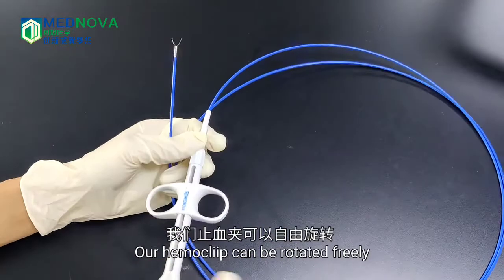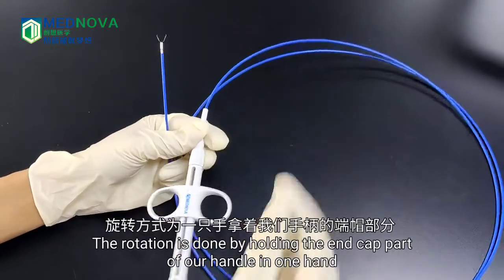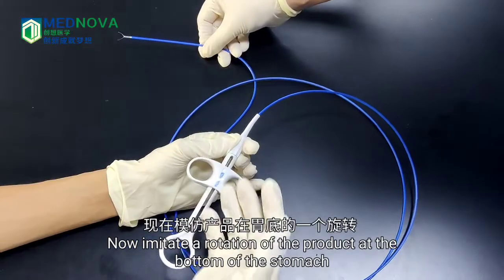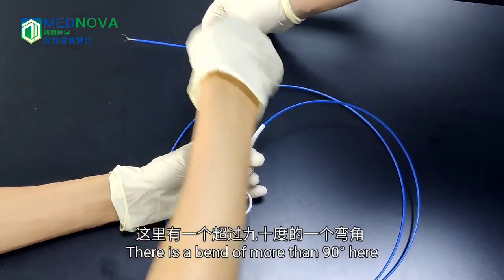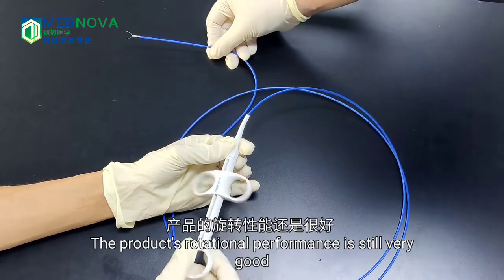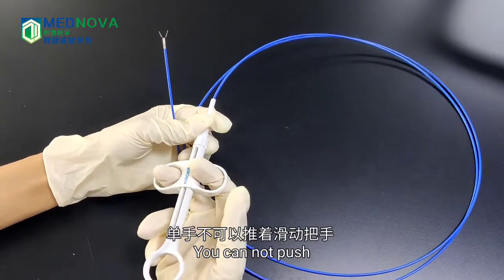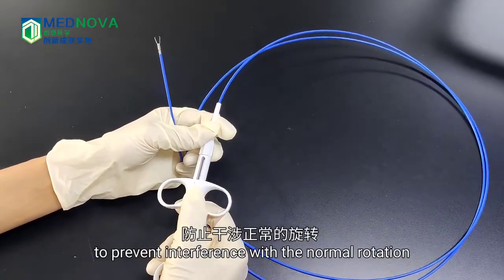Our hem clip can be rotated freely. The rotation is done by holding the end cap part of the handle in one hand and the handle in the other hand. Imitating the rotation at the bottom of the stomach, there is a bend of more than 90 degrees here, and here are two more turns. The product's rotational performance is still very good. Please note that during rotation, you cannot push or pull the side handle, to prevent interference with normal rotation.